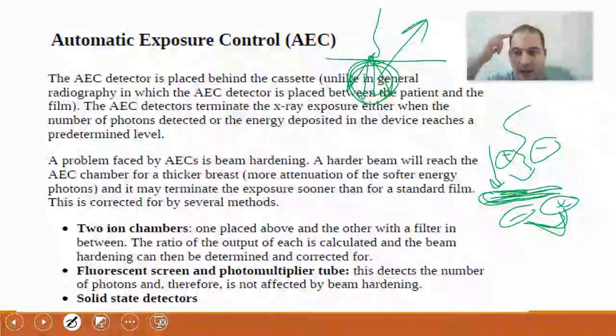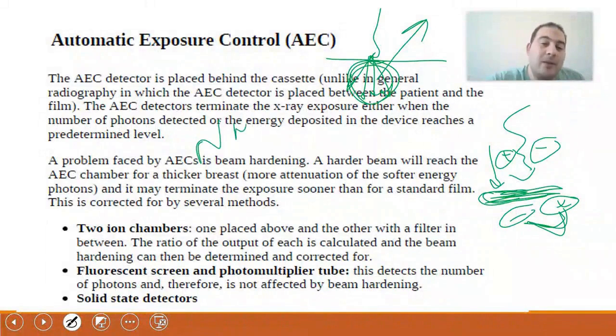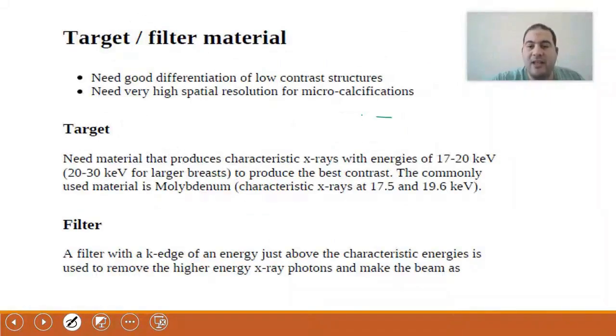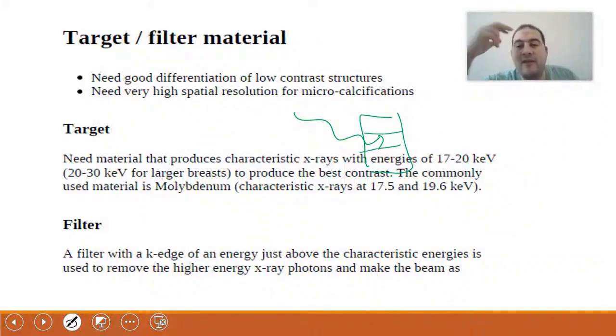The mechanism in the detection process relies on something called scintillation or scintillator material, specifically sodium iodide. Sodium iodide receives the radiation and contains scintillator material. This scintillator material is the same concept as PSP. Phosphorus here is not functioning. Why is it not producing this electron?